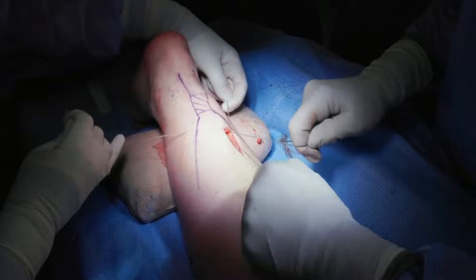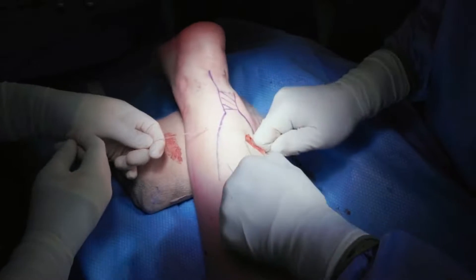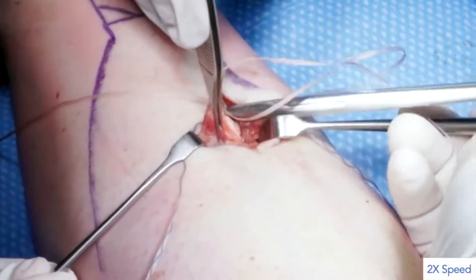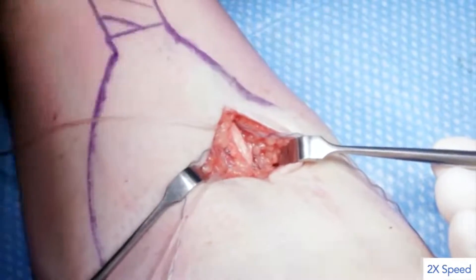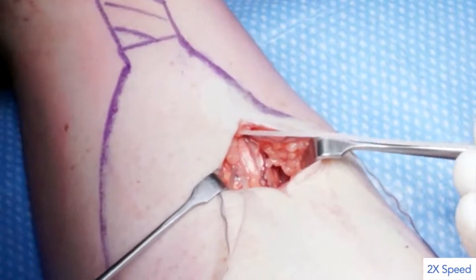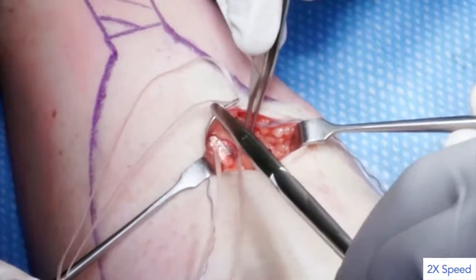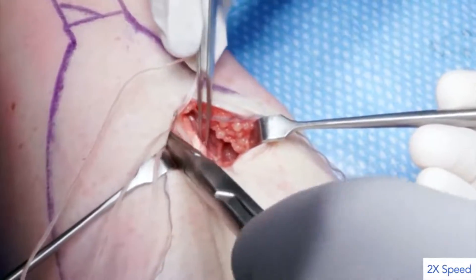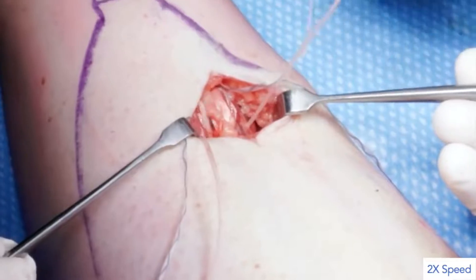After removing any suture creep by pulling firmly on both ends of suture number 2, both remaining sutures can now be anchored within the Achilles tendon proximal to the rupture site. With the foot in maximal plantar flexion to facilitate tensioning, a free curved needle is used to complete passage of the medial and lateral ends of suture number 1 across the proximal tendon aponeurosis. The two ends are directed obliquely across the tendon and perpendicular to each other in a sling configuration before being tied together.